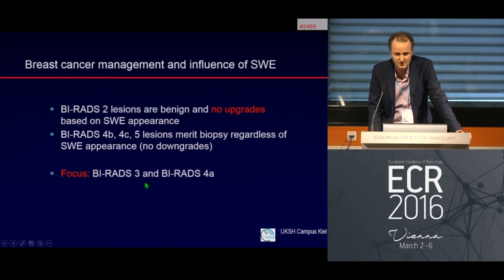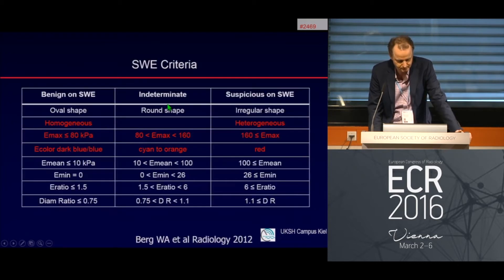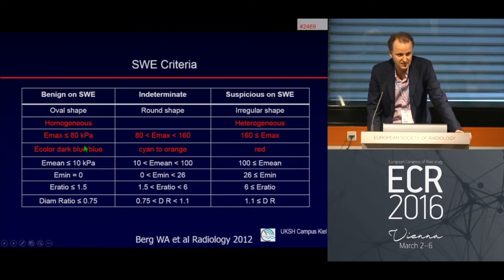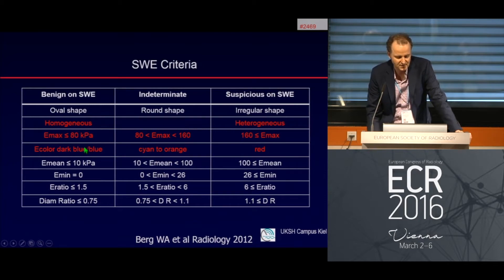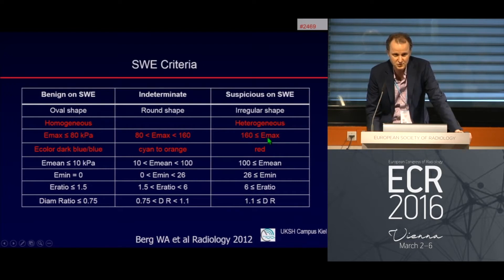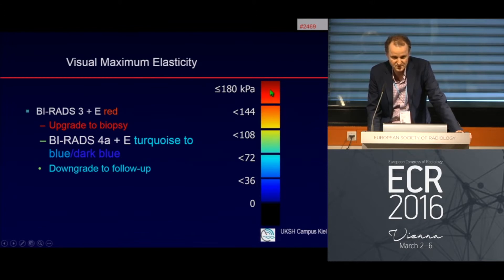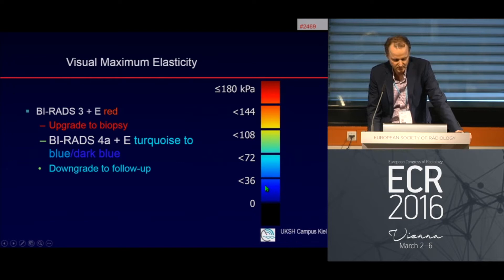The BI-RADS 3 field is a very large area we must focus on. We know different shear wave elastography criteria. Benign features include a very homogeneous signal, elasticity maximum less than 80 kilopascal, and dark blue color. Suspicious features include irregular shape, heterogeneous elasticity, very stiff tissue with elasticity maximum over 160 kilopascal, or red color — red means dangerous, like a stop sign.